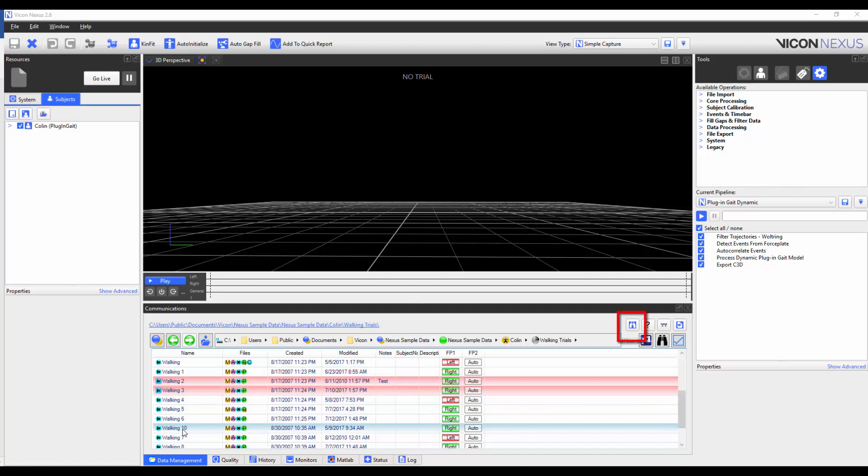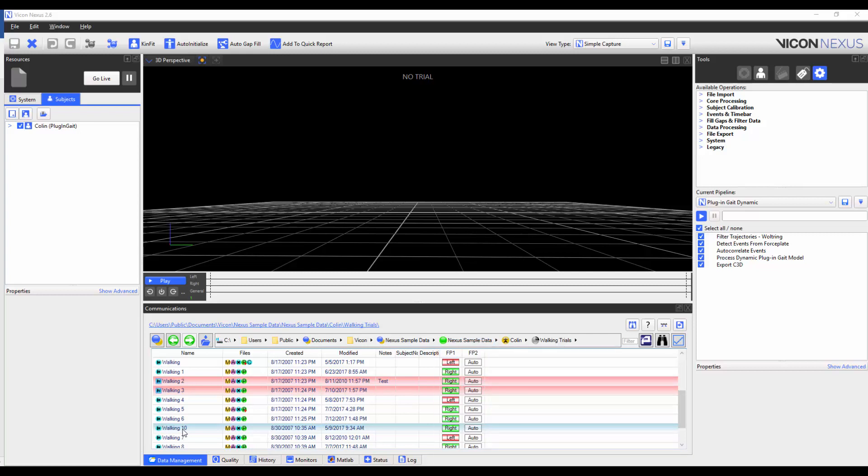There are also updates to the search function, which is covered in the data management video. The force plate columns now distinguish between left and right, where left is red and right is green. There are also additional options for custom data fields and a new backup or archive feature that will be discussed in greater detail in the data management video.